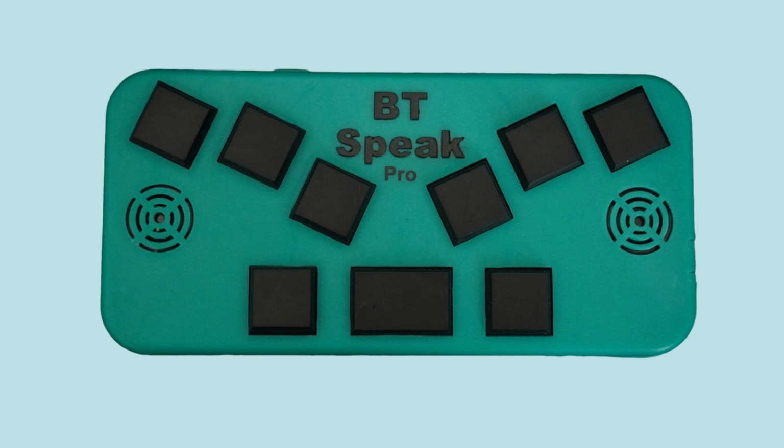Okay. Now what's cool is that this is going to read normally, and the reason why is because the clipboard automatically translated this end of file into contracted Braille. So eager anticipation of a short while later Ruby stood at the TARDIS doors, brimming with the eager anticipation of a child on their way to Chessington for the first time. So it read it perfectly, but it converted it into grade 2 or contracted Braille because I'm in a file that's using the UEB table.